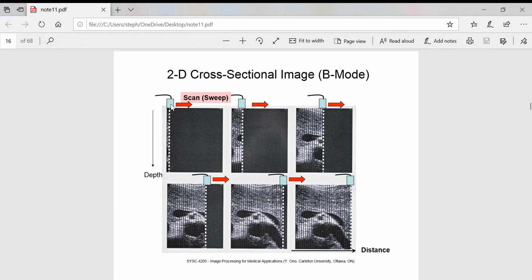All of this can tell us what material we've come into contact with and approximately where it is in terms of depth. If we sweep this across, it's a sort of CT-scan-ish procedure where we're sweeping across the object and getting a slice of the object every single time. What we end up with is our 2D image.